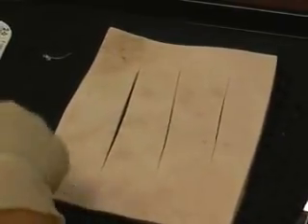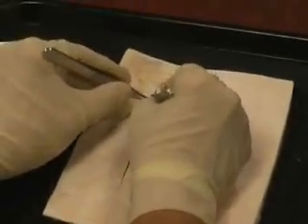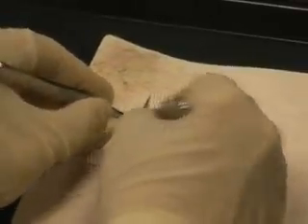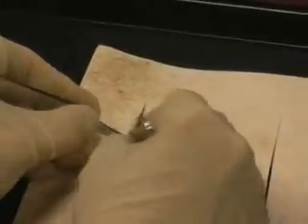So what I'd like for you to do in class is practice being the everter as best you can. You're going to hold and evert and the person staples, and you're just going to do that a few times. The person who's the stapler is going to be going along, and I'll just pretend, I guess, from this direction. This is the staple gun.